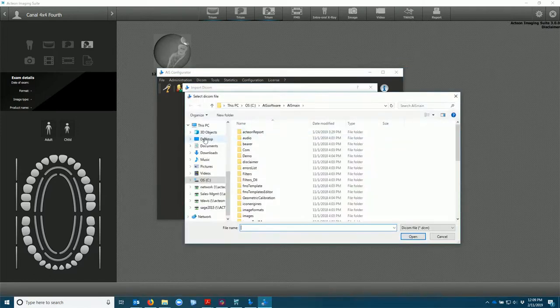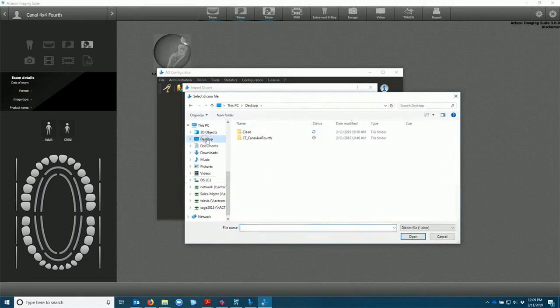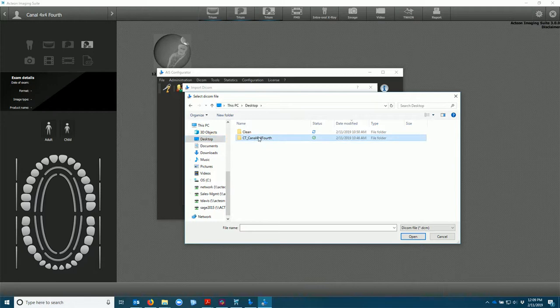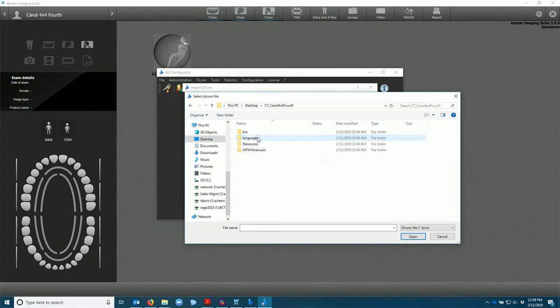From that point we're going to select the folder. In this case if it's an exported scan you can select just that folder even if it has all of the files underneath it.